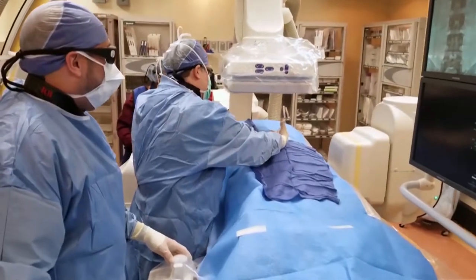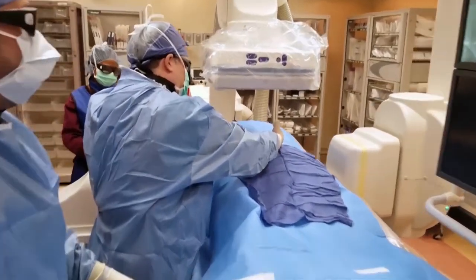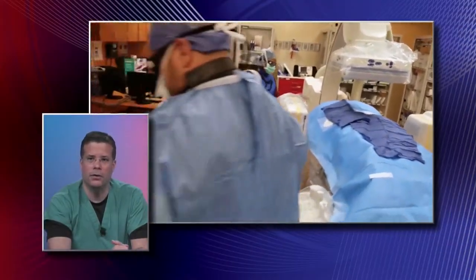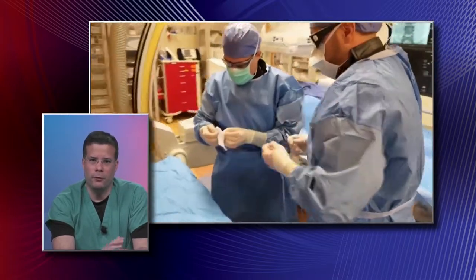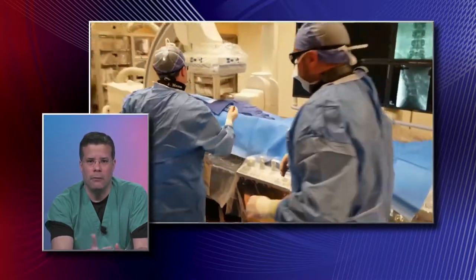We have a tube sitting on top of the patient that provides us the anatomy we need to look at. We go ahead and clean the area, keeping it as sterile as possible. After we count and make sure it's the right level, we do a timeout and proceed.